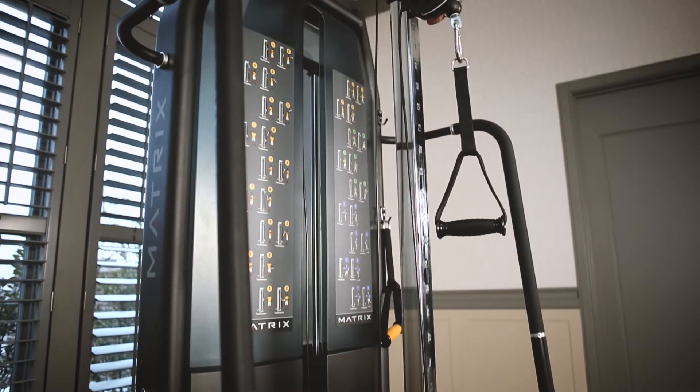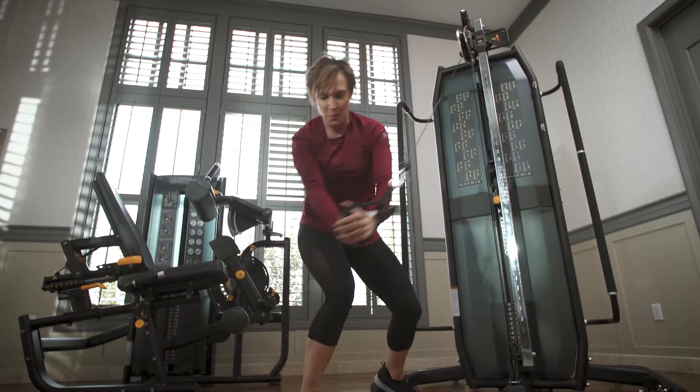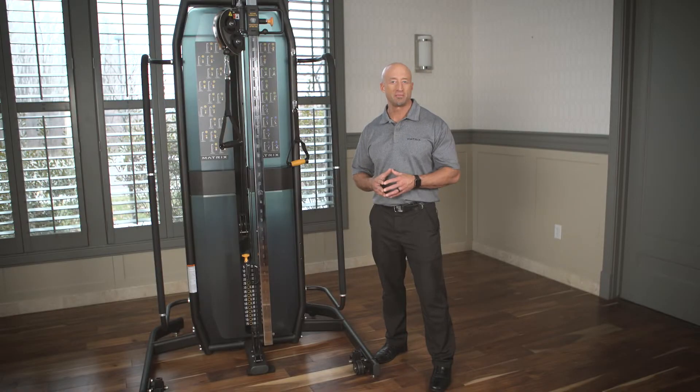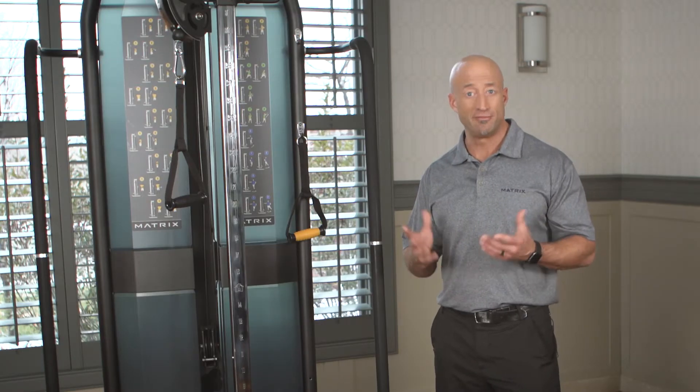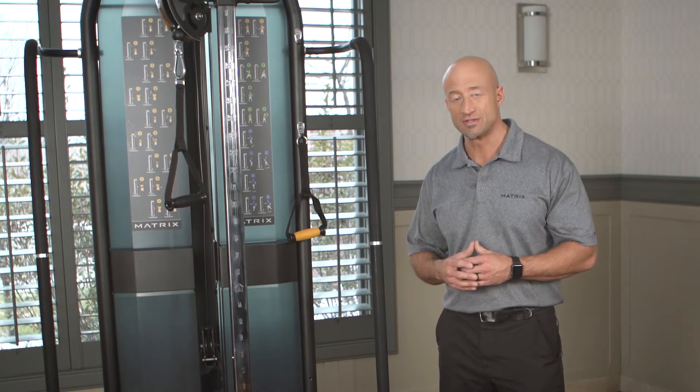I'm going to show you our new Matrix medical adjustable pulley. An adjustable pulley is something that's commonly found in health clubs, rehab centers, and hospitality. It's a very versatile and functional unit that you can do a lot of different exercises on.